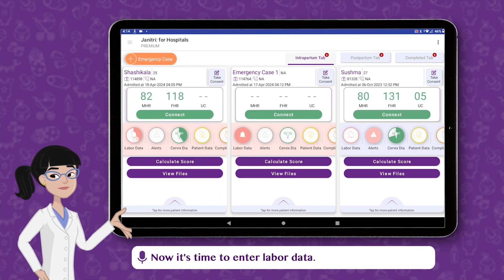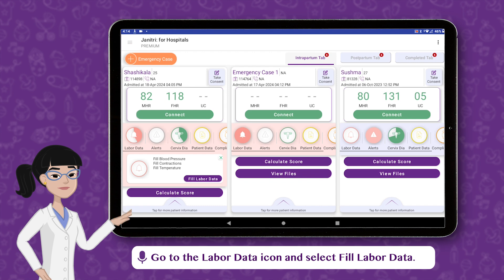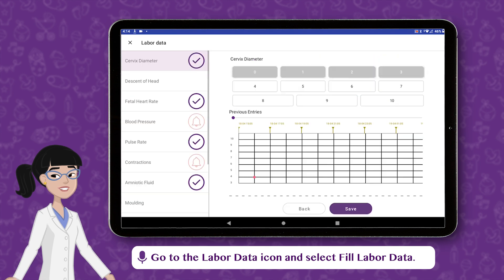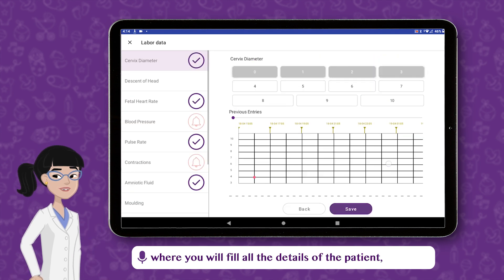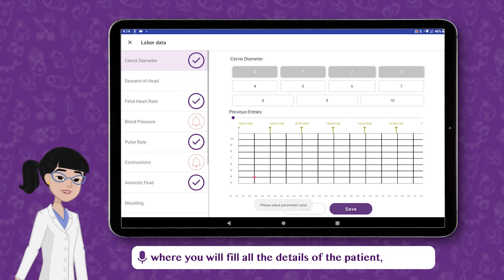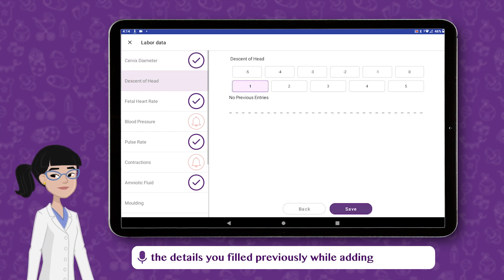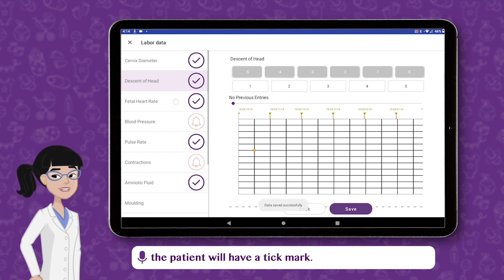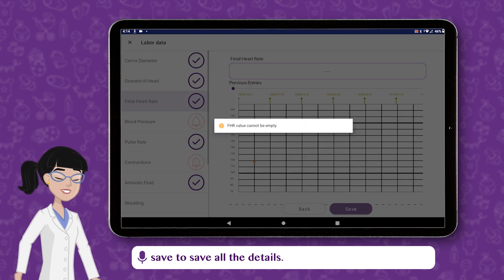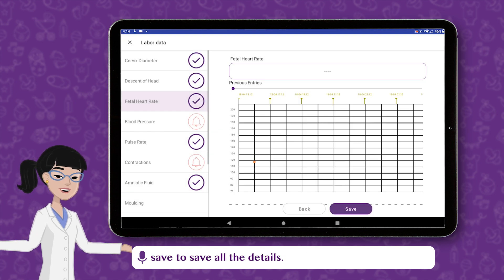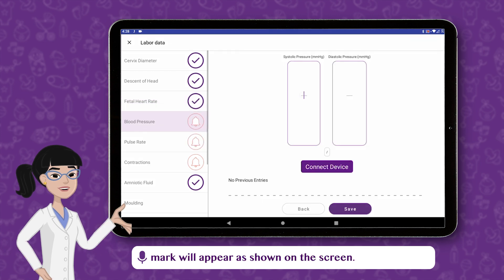Now it's time to enter labor data. Go to the Labor Data icon and select Fill Labor Data. Another screen will open where you will fill all the details of the patient. The details you filled previously while adding the patient will have a tick mark. Enter the details and select Save to save all the details. Once saved, a tick mark will appear as shown on the screen.